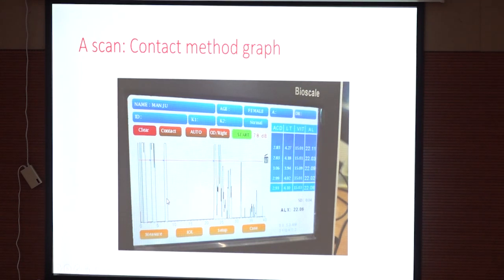The third one is because of the posterior lens capsule. Then we have a flat vitreous face, and then the retina shows a spike which is very sharp, followed by a scleral and then retroorbital spikes.